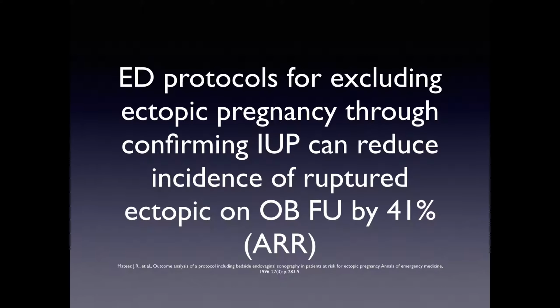ED protocols for excluding ectopic pregnancy through confirming intrauterine pregnancy can reduce the incidence of ruptured ectopic pregnancy by 41%. That's an absolute risk reduction. That's a huge number. So following the protocol that we've laid in place here will greatly benefit your patient.